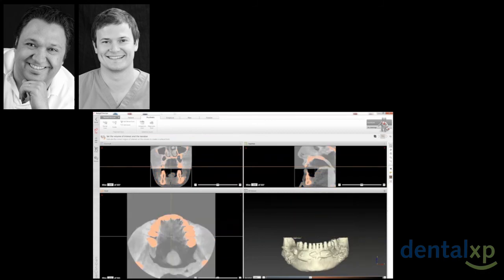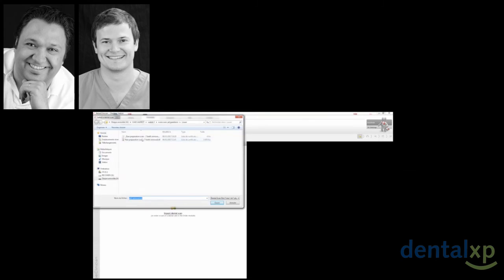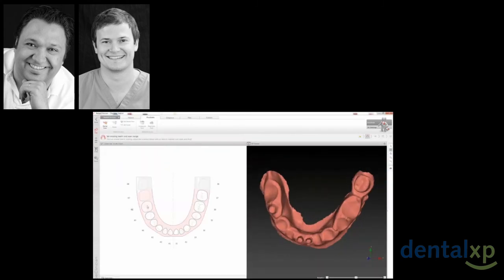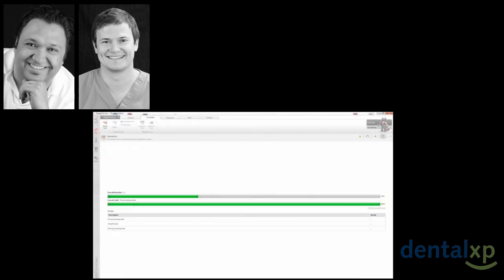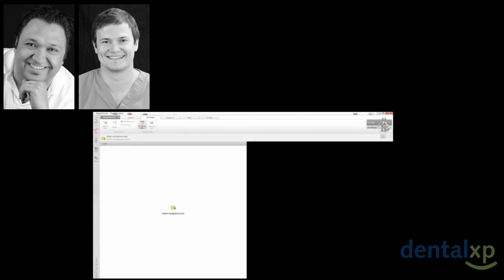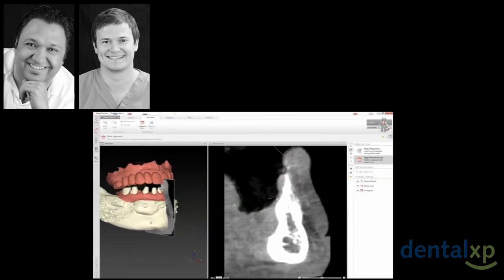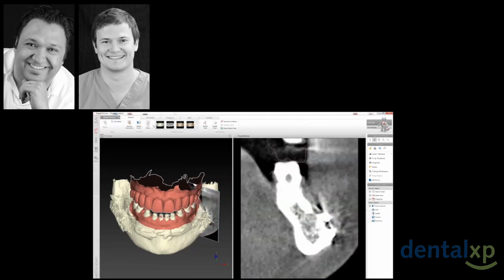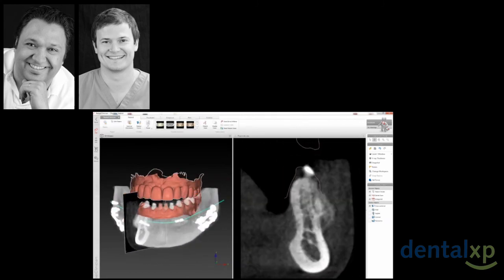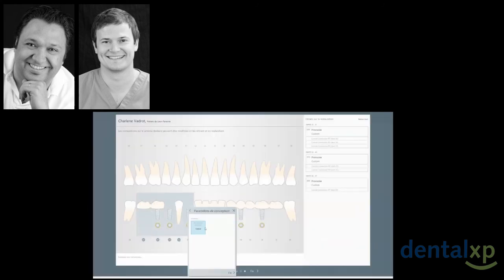Let's take a quick overview of the whole procedure. First, we import the CBCT DICOM file of the patient. You can see the bone grafting on the bony model. Then this data is merged with the digital impression with only 4 references. In cases like that, with a small number of references, I urge you to check the accuracy of the fusion before going any further. In this case, the software was not able to produce a smart setup. That's normal because it's not the right parameter for doing so.